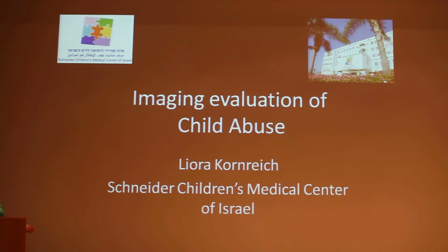About the imaging evaluation of child abuse. You don't hear me, that's a problem. You talk about the imaging evaluation of child abuse, and I would like, first of all, to reassure you, it's really a topic that is related to violence, but we won't see any shocking images here.